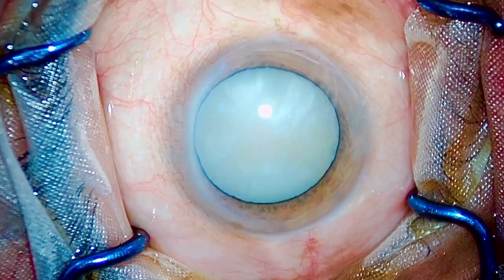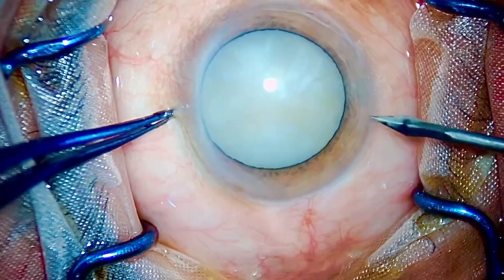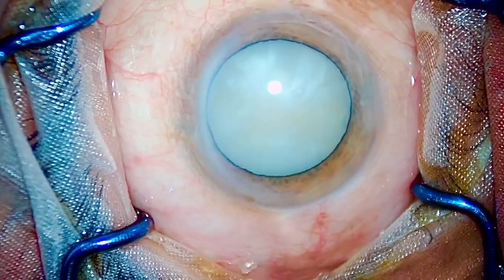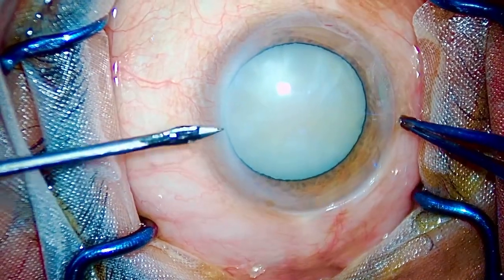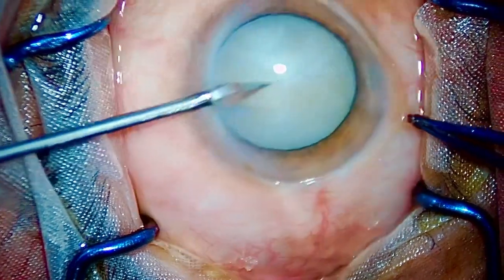Dear friends and colleagues, this is Dr. Seymann Chilgoyal. Today I am going to discuss and show you a case of hypermature Morgagnian cataract, and as the thumbnail suggests — talent versus Zepto.